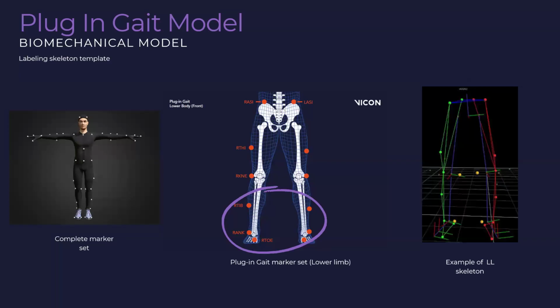The other thing is, for your specific project, why do you do gait analysis? Not for the insole, for the exoskeleton? And for the exo, because for the control system of my exo, I need some specific information on the gait stages, and I need a kind of gait assessment to know how I can assist the subject and how much I need to assist the subject.